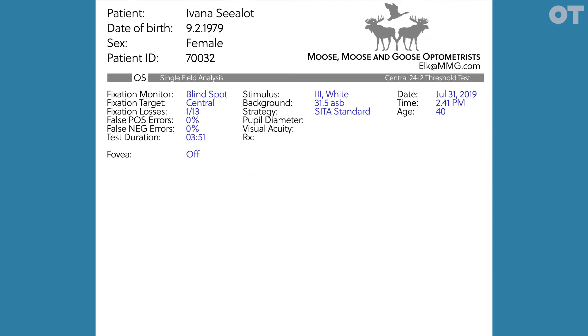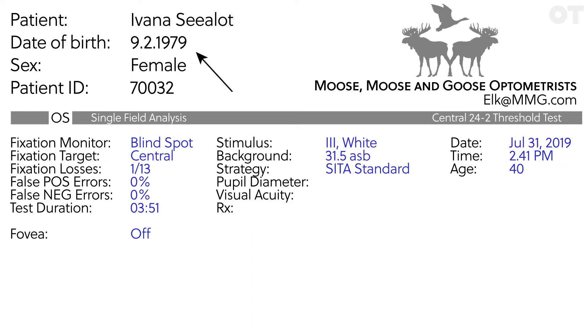Ensure the patient's details are correct. The date of birth must be correct as it is used to compare the patient's results to the age-matched normal database. Look at the date. What test strategy was used? In this case SITA standard 24-2 threshold.